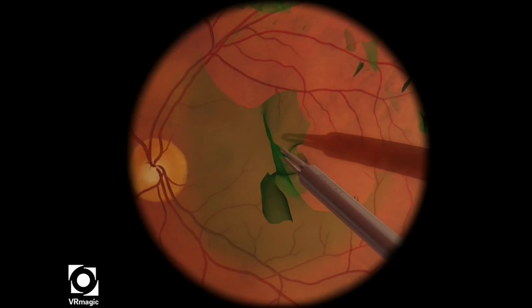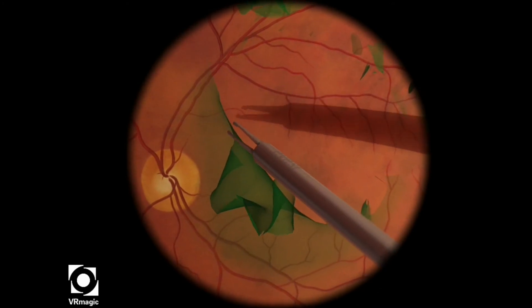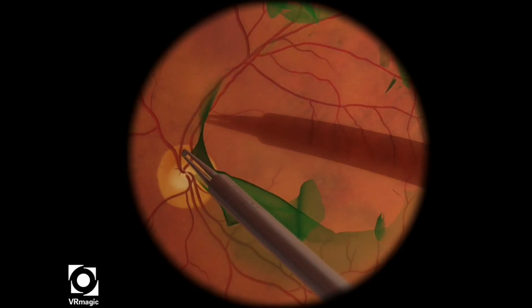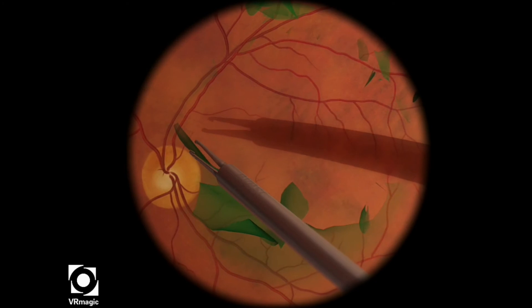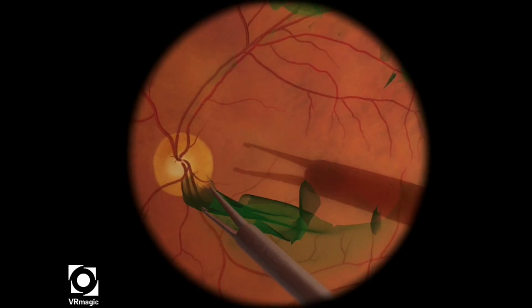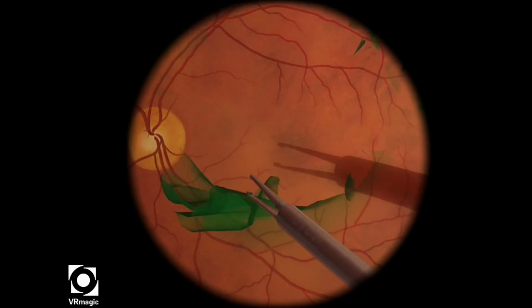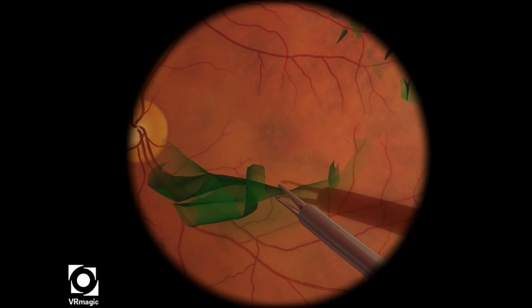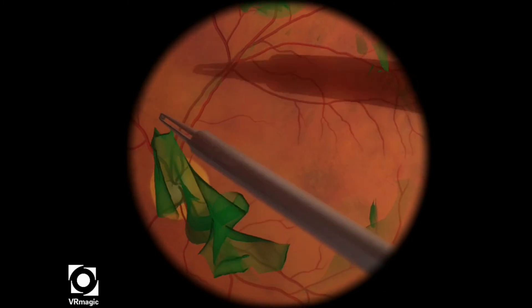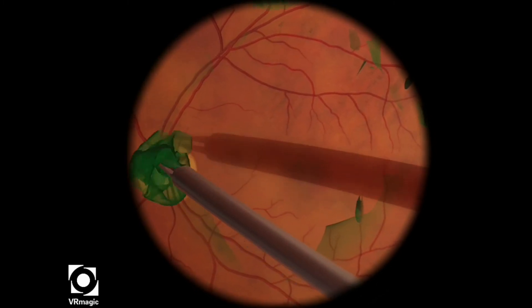One thing I could improve on is to continue trying to keep the eye in primary position. But as you see here, once you get a nice large piece, you can kind of propagate that piece as much as possible. And then I've gotten a large, nice piece of ILM there.